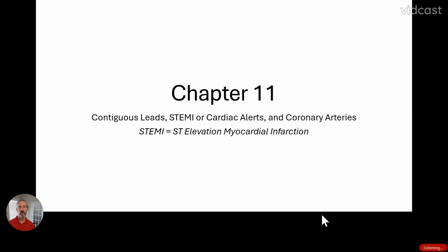Today, we are going to focus on contiguous leads and the criteria for calling a STEMI alert or cardiac alert. So remember, STEMI stands for ST segment elevation myocardial infarction. I will also be showing you a trick or a tool to help you remember what artery might be associated with the heart attack that your patient is having.